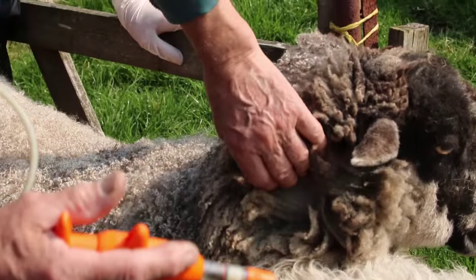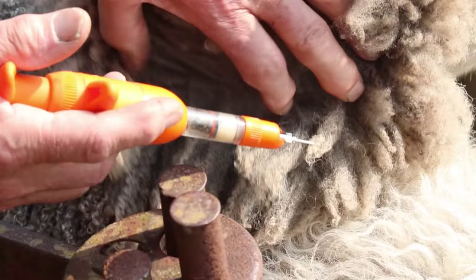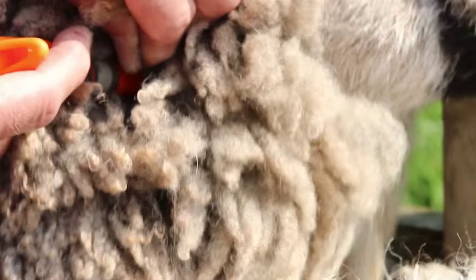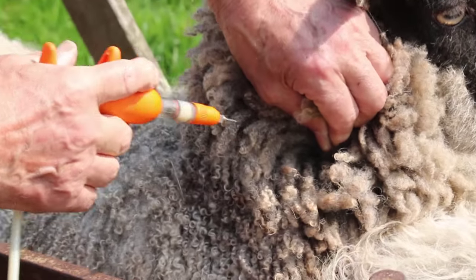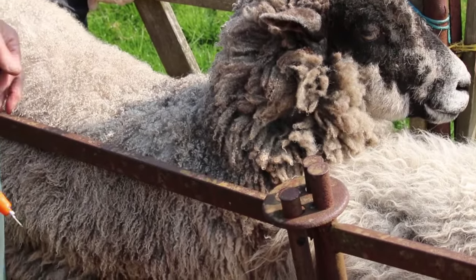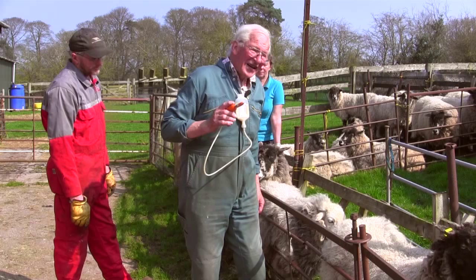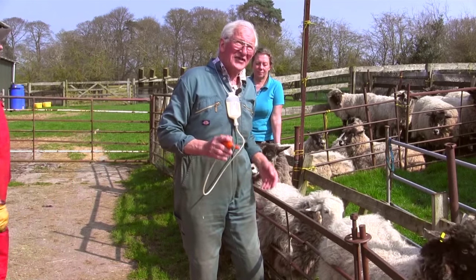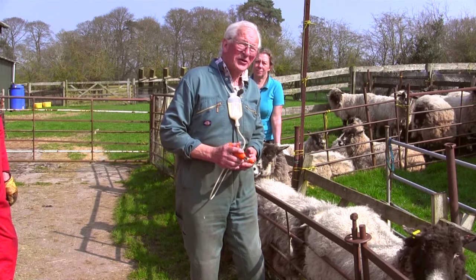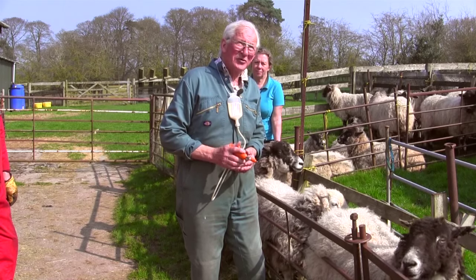The correct technique to vaccinate these sheep is halfway on the neck, under the skin. You part the fleece, pick up the skin, put the needle under the skin and inject. It's quite easy with a well-fleeced sheep — you can steady the head by holding the parted fleece, which makes it easier to find the right spot. It's important that if the product says go under the skin, you go under the skin carefully, because if you go into the muscle with some products, that product will track into the spinal cord and cause the animal great problems.